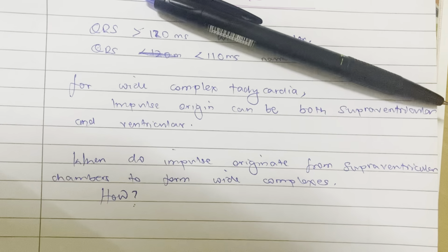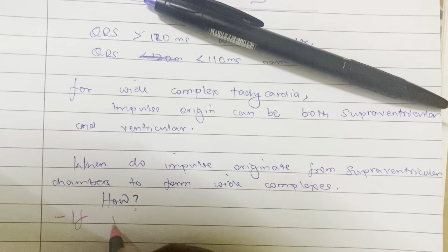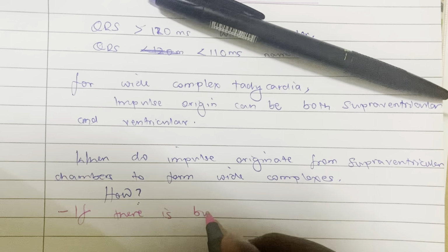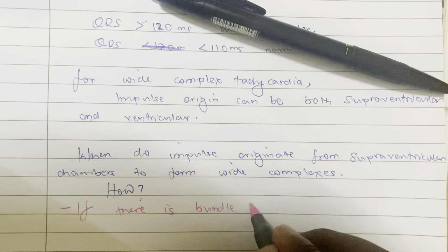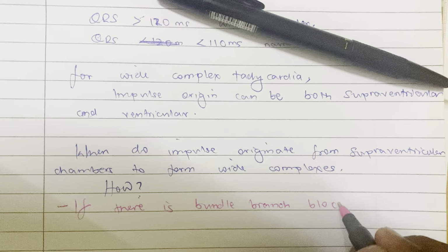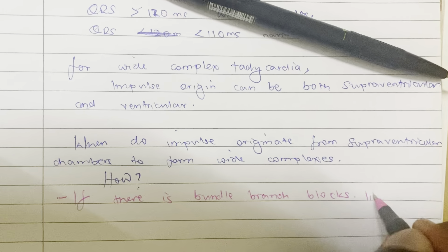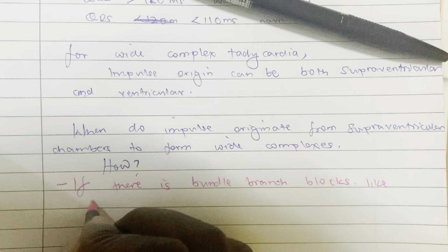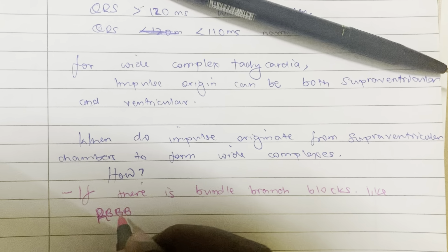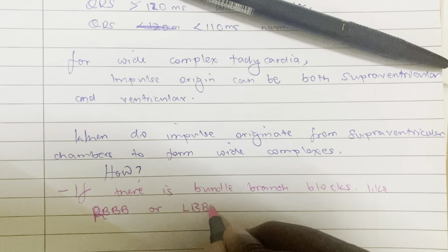One is if there are bundle branch blocks, like right bundle branch block or left bundle branch block.